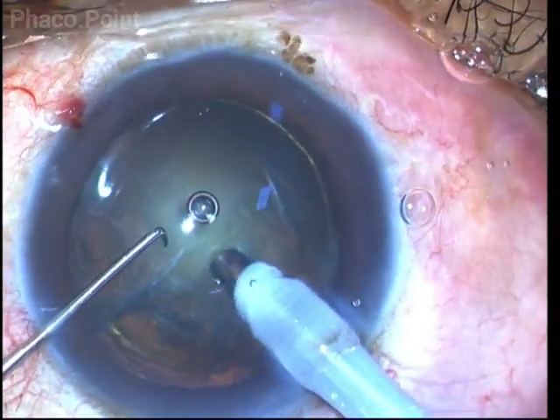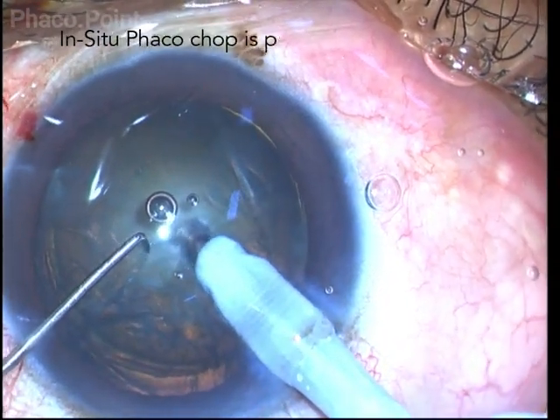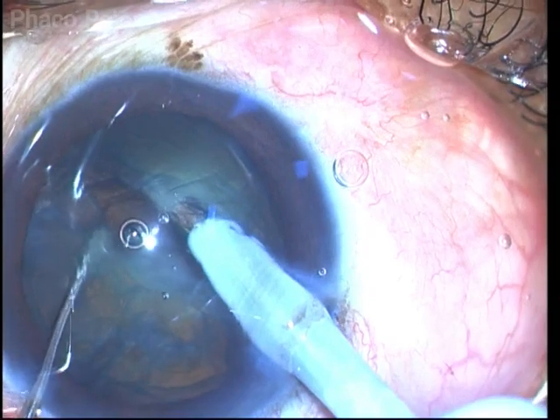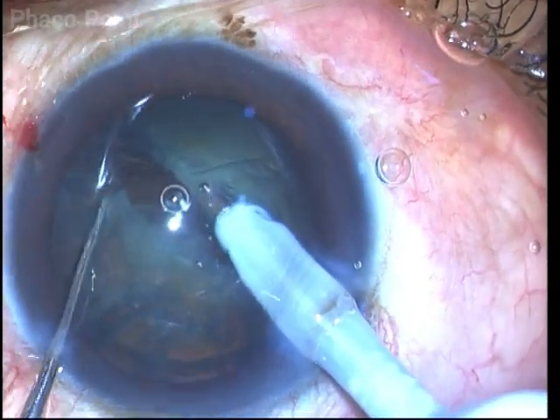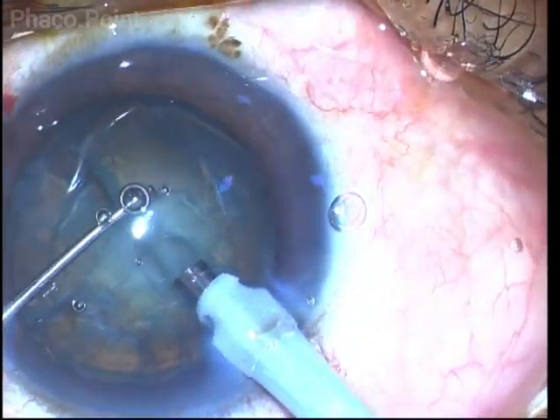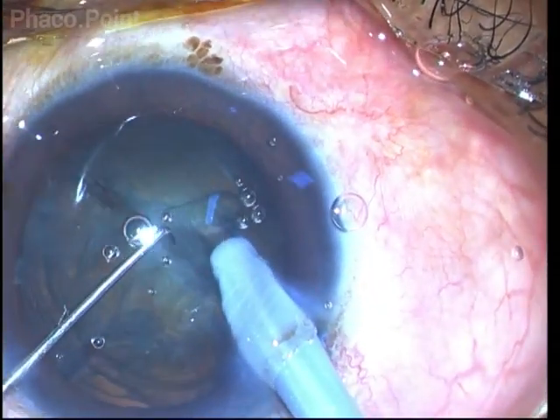In this case, since nucleus rotation is not possible, I perform what is known as an in-situ chop. This is a grade 2 nucleus sclerotic polar cataract. So after burying the phaco tip, I am able to crack it into two halves without rotating the endonucleus.